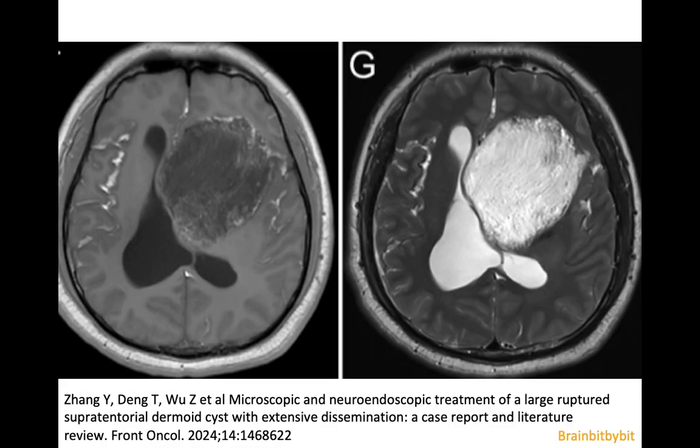These are MR images from the same patient, and you can see that the content of the cyst is not as homogeneous as, for example, an arachnoid cyst.